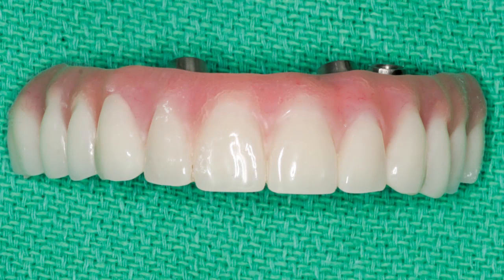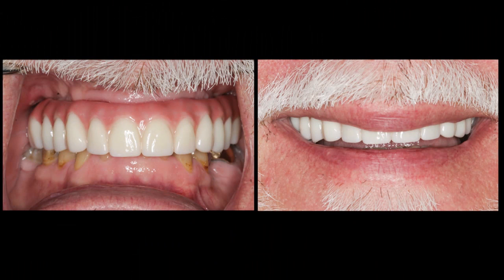When the patient presents with a fractured or otherwise damaged prosthesis, repairs can be made before the fabrication process begins. After attaching the Bruxer full-arch implant prosthesis to the implants and sealing the screw access holes, the new restoration provides the same form and function as the appliance to which the patient has become accustomed.